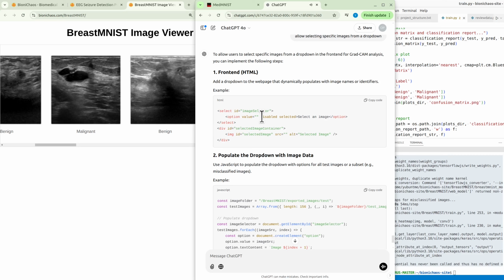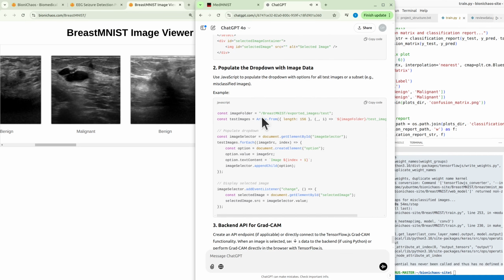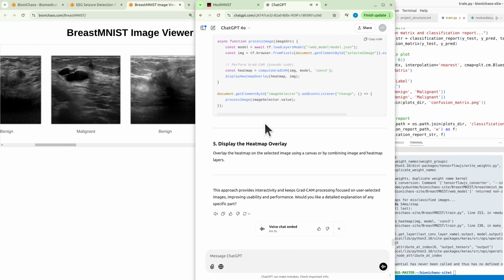7. Documentation and logging. Create a readme.md for developers, documenting the data flow and how to execute each part of the pipeline. Log training configurations and results in a standardized format for reproducibility.